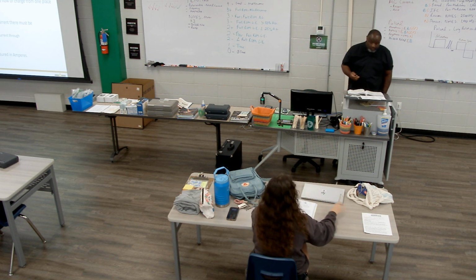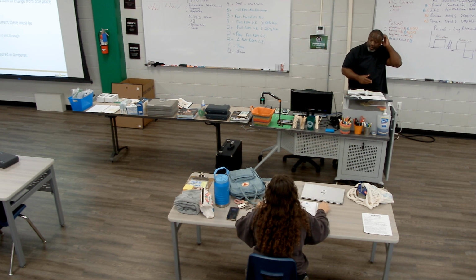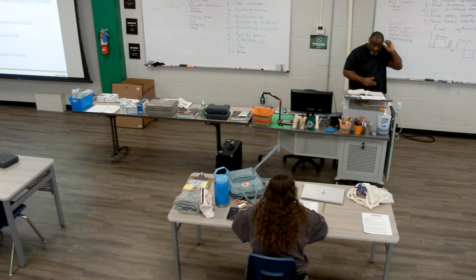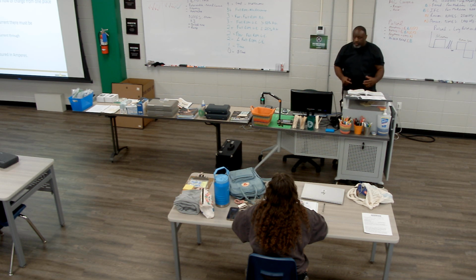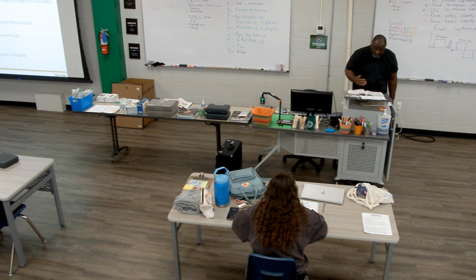So it says current will flow under two conditions. One, when there's a source of energy creating electrical potential. We understand that. We have to have some type of generator. That's what the machines are. And two, when there's a pathway between the two potentials. So we need a pathway and we need a generator. We have that.